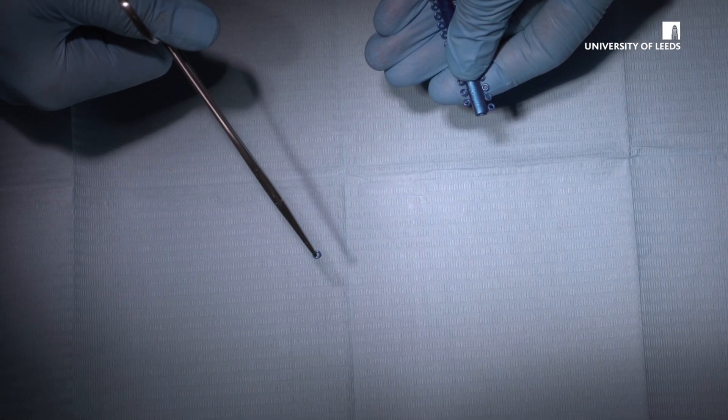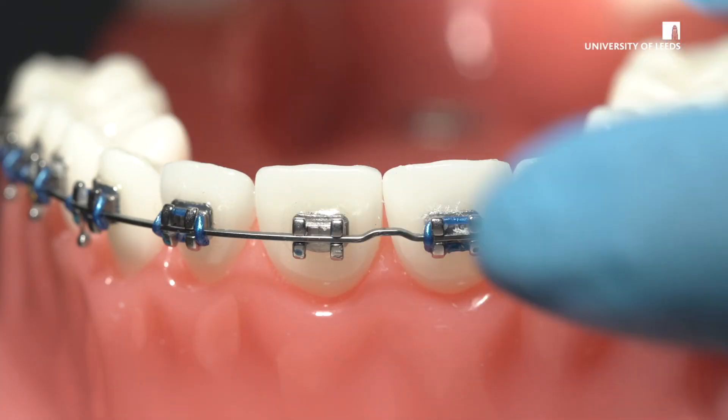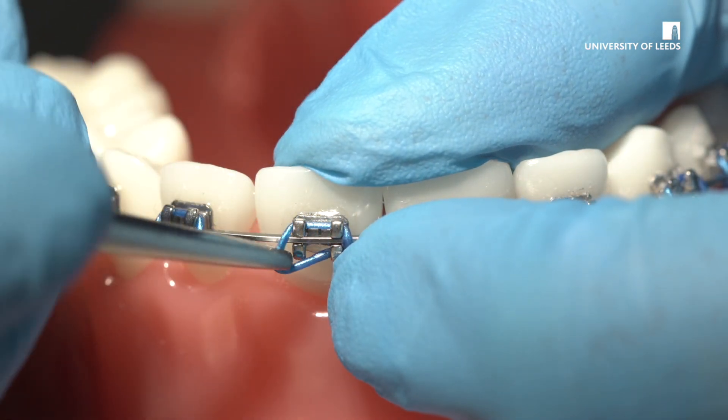When placing the module, start at one corner of the bracket and place the module around each tie wing like so.